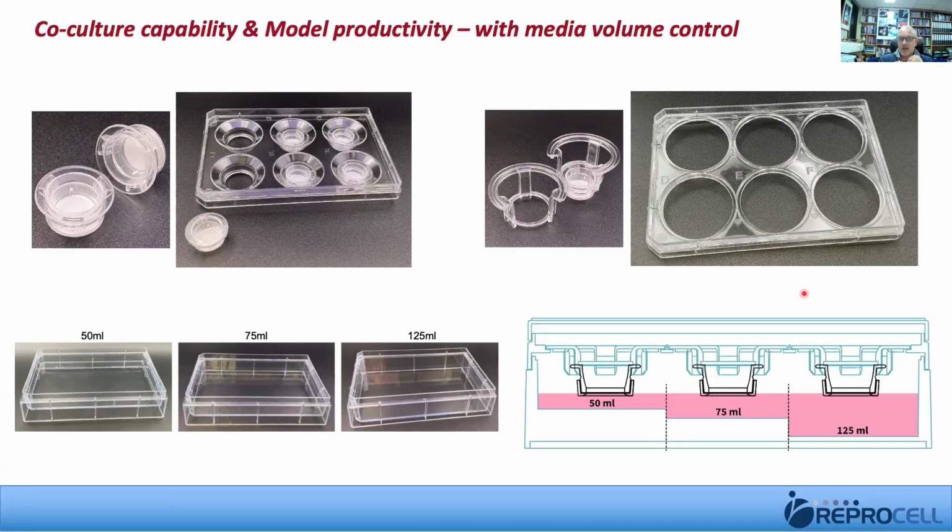It is multiple layers of many cells, and you are trying to maintain the viability of a tissue equivalent over multiple weeks. So to be able to do that, you need to think about the regime by which we're going to maintain those models, minimizing the number of times that one has to interact with them for media changes, etc., etc.